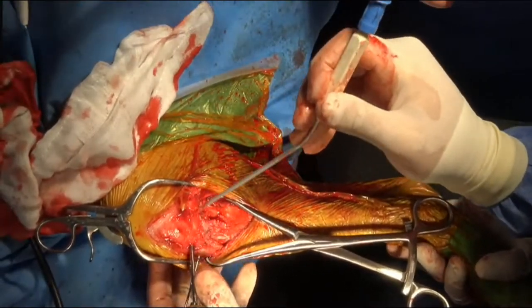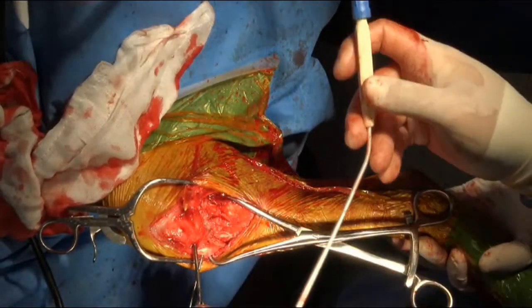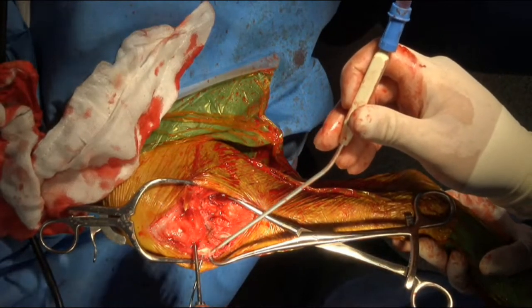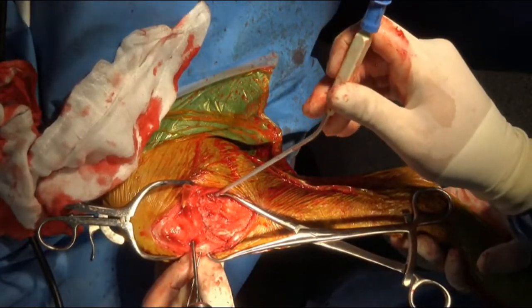Okay, guys, so we can see our osteotomy here. I'll just make sure you can actually see that. You can see our osteotomy here. We can see our marks that we've lined up here and here. I've still got my rotational pin in here, and I've just put a first 062 pin across the proximal fragment into the distal fragment here.